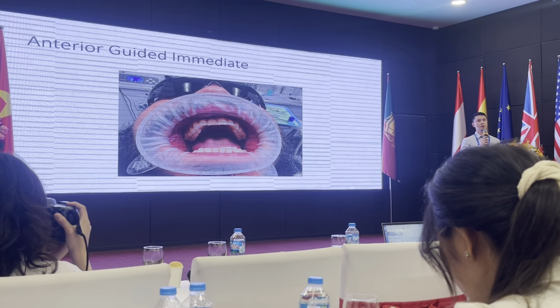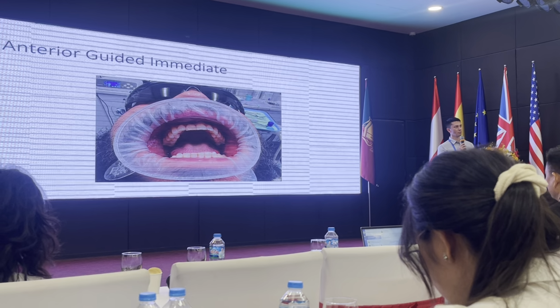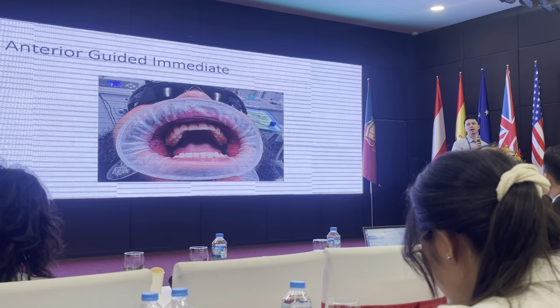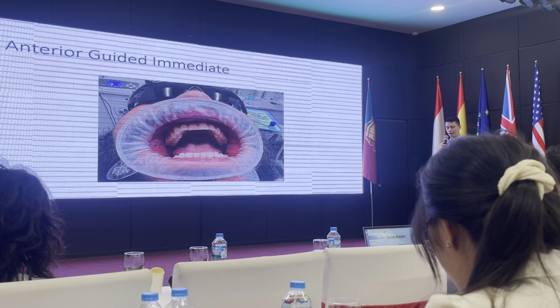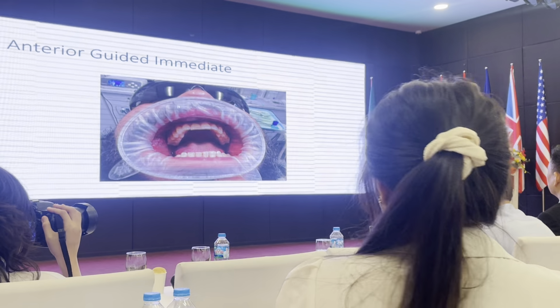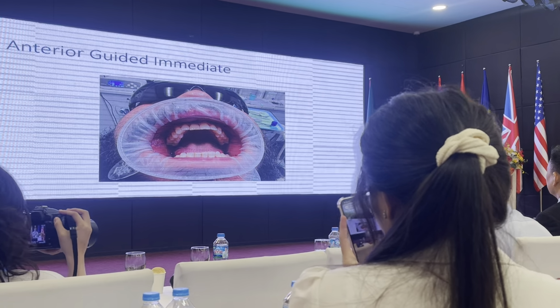Maybe this is a patient that walks into your office in the morning with an emergency, they broke a tooth, they're in a lot of pain, and they don't have time to wait for us to generate or print a surgical guide, and they want us to help them as soon as possible.